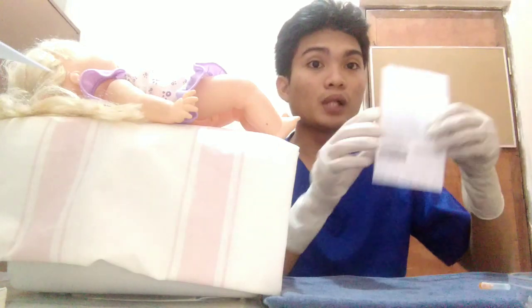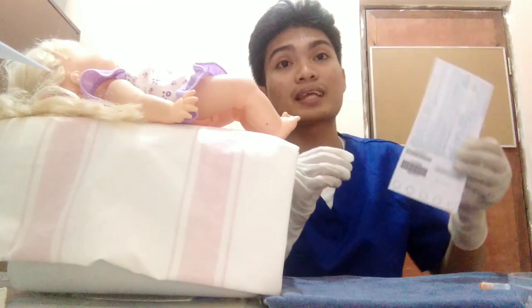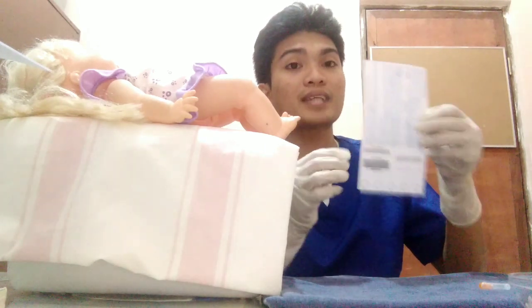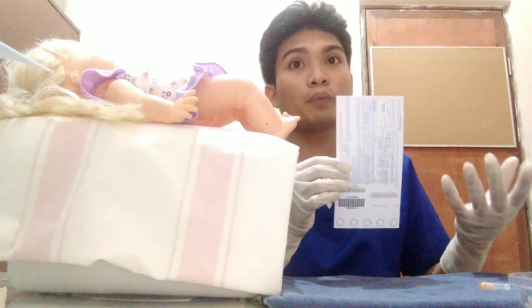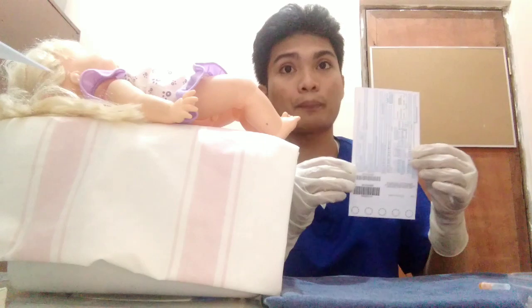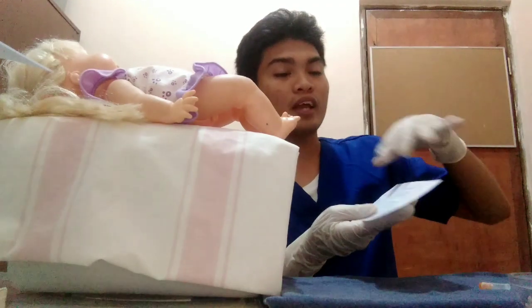We have to make sure that the blood on the bottom part is already dry before putting it inside the envelope, in order for us to elicit an accurate result. Now, the completed ENBS filter paper will be sent into the courier. And the courier will be the one to deliver it in the laboratory where the newborn screening will happen. And we have to make sure that all of the information written here is verified and accurate.